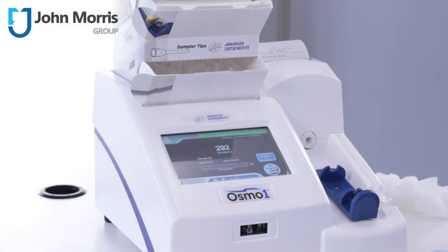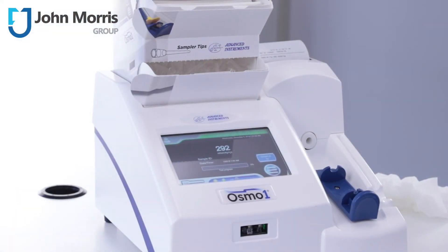No more writing in a notepad — you've got built-in quality control, and the unit allows for QC data over time with exportable Levy-Jennings charts. No manual data recording. The Osmo One will issue a warning when QC is out of range so users can react in real time.